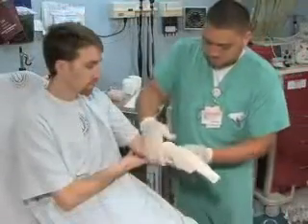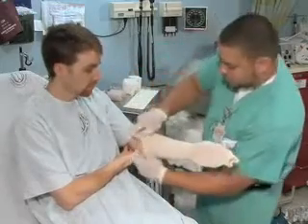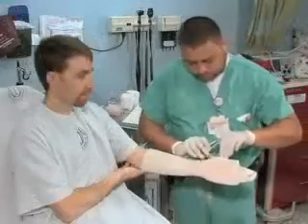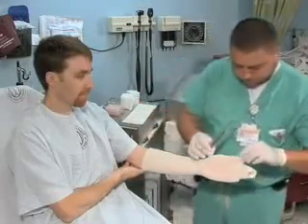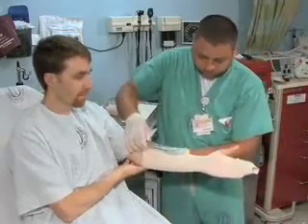Apply the stockinette to the extremity, avoiding wrinkles and using sufficient length to extend 10 centimeters beyond each end of the splint. Use scissors to cut an opening for the thumb. Cut a small hole in the stockinette where it lies across the base of the thumb and then pull over the digit to prevent wrinkles.